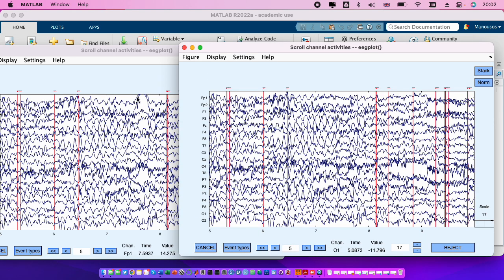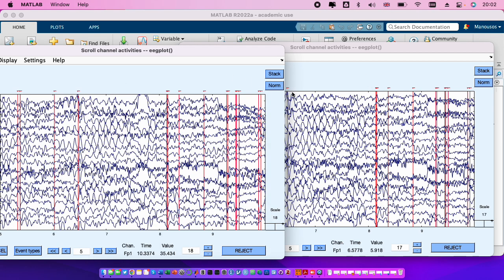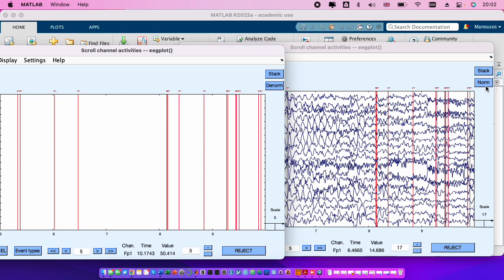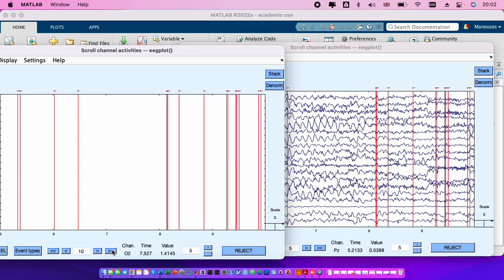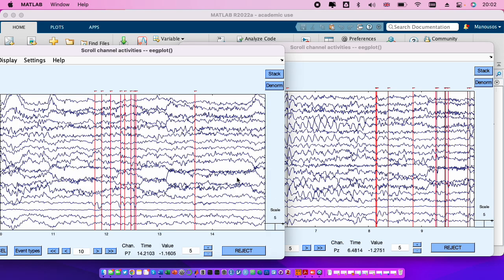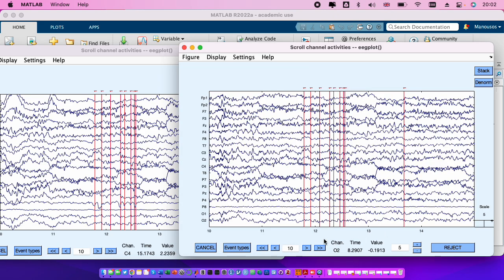And you see for example, you see here that we have an artifact, a blink, that now it's removed while the rest, the alpha activity and so on, remain the same. And if we norm both it's much more visible. You see that what are the red ones, the red lines, are some events.